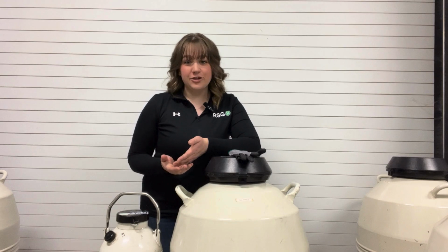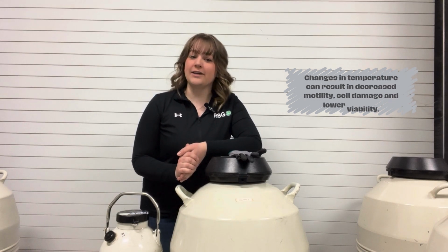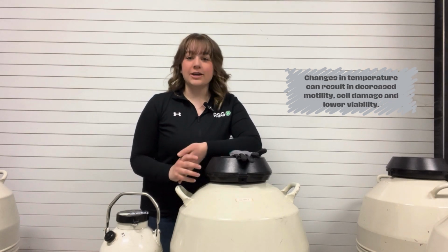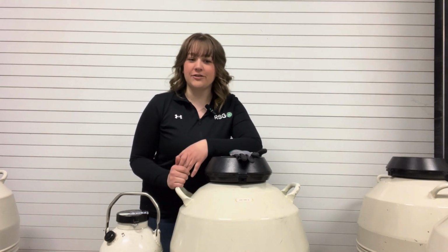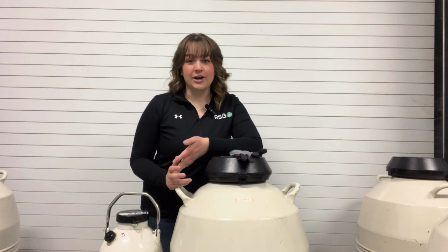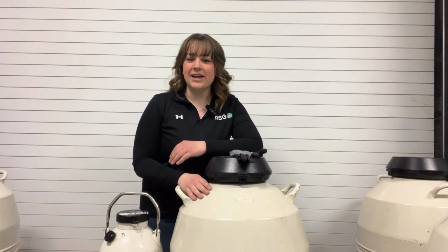While it would be easy to just pull those 2 straws from the cane with your hand and put them in your client's tank, we need to remember that changes in temperature can have a very negative effect on semen quality. Liquid nitrogen maintains the temperature of the frozen genetics at around negative 300 degrees Fahrenheit. Your hands and even the air are a lot warmer than that. So let's take a look at the safest way to get that semen from your tank to your client.